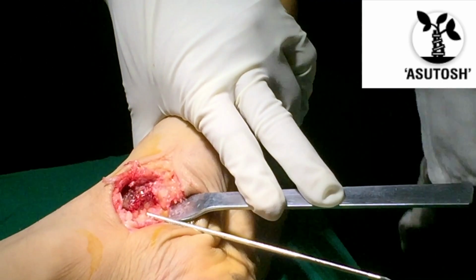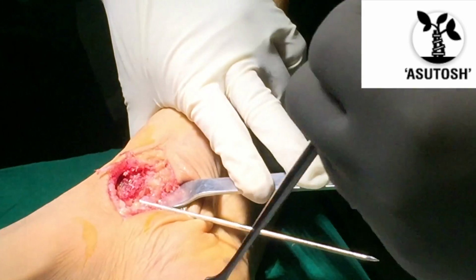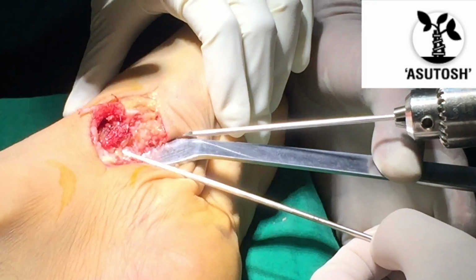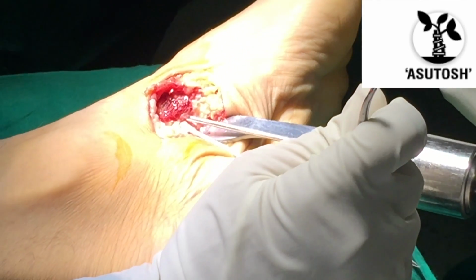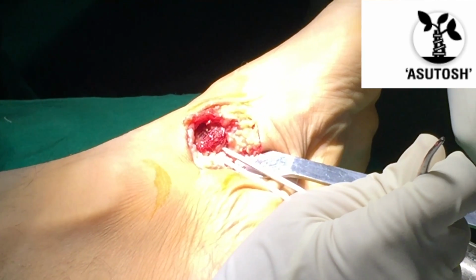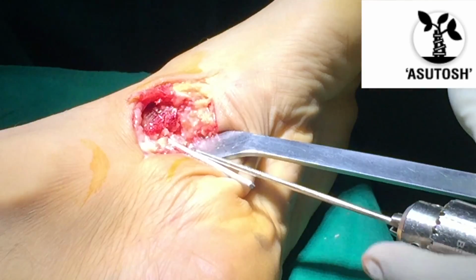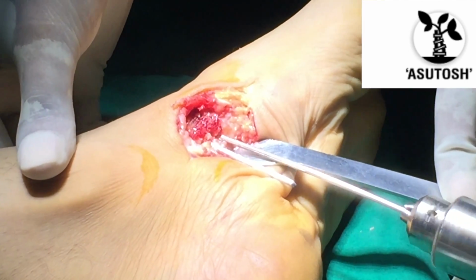Another drill hole is planned to be made into the anterior portion of the navicular, so that the posterior tibial tendon would be rerouted into that canal that is going to be drilled right now. You can see the inferior cortex of the navicular being drilled with a drill. We need to take care to prevent splinters occurring in the navicular.